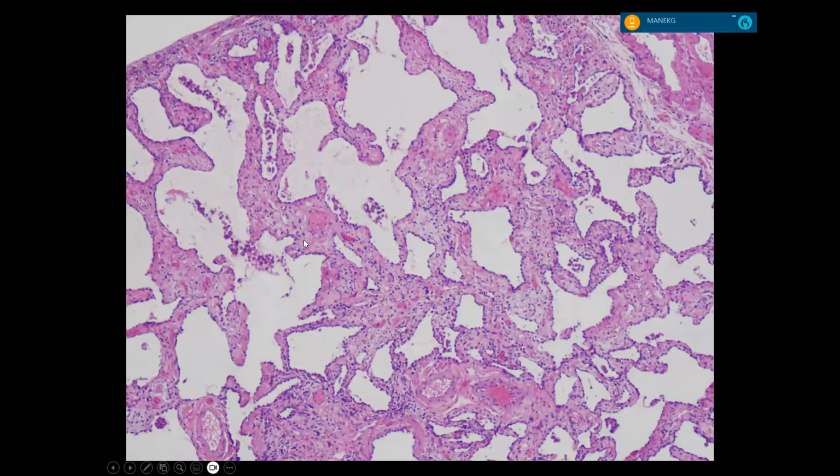So no giant cells. What about that one? That is blood. But you're right about the lymphocytes. LIP is just teeming with lymphocytes; it should be blue. NSIP. About the convention, yes. LIP is, I think, seen in Sjogren's, not scleroderma. Correct. So if they want you to give LIP, they really should give you Sjogren's in the history. Otherwise, it's basically vanishingly rare to ever get a real LIP.